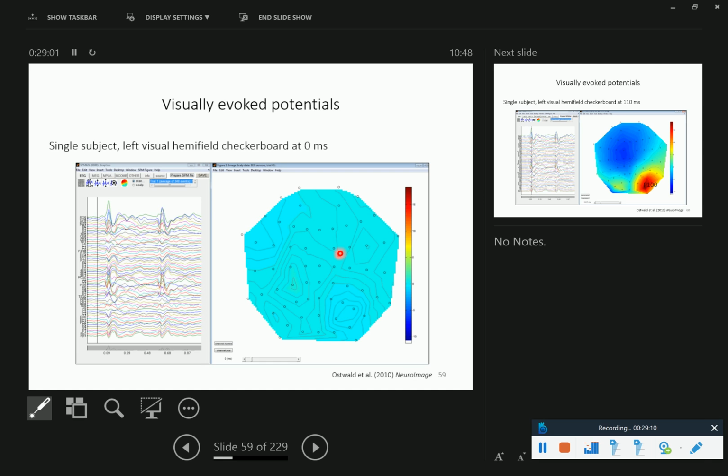These little dots here are the actual electrodes. And then you can, of course, spatially interpolate. If you only have values from where the dots are, you can fill in the space between dots based on an interpolation, for example weighting by the distance between them, so that in the middle between two electrodes you have exactly the average value of the two electrodes.